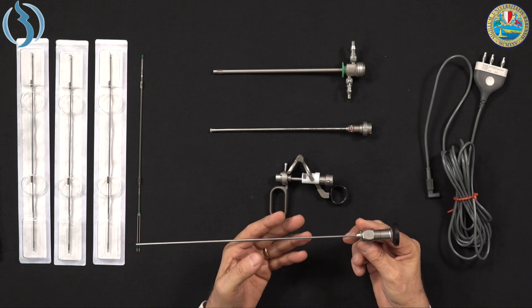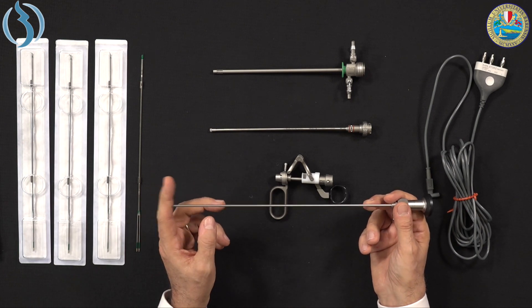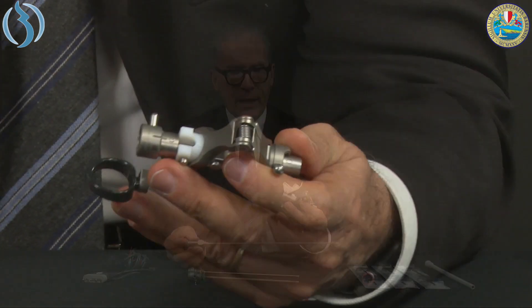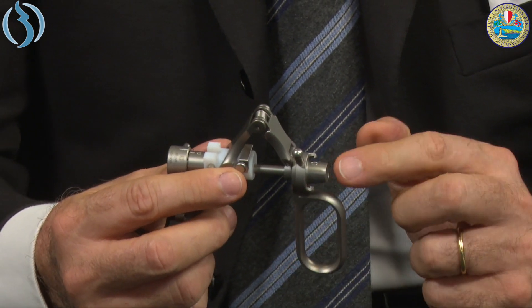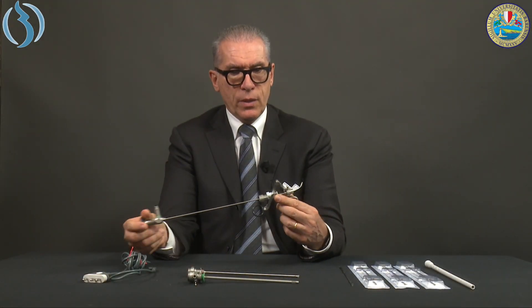Now we are ready to assemble the mini resectoscope. These are all the parts. We start with the optics: a 0-degree, 2.9 millimeter lens — there is no alternative because the loop is so small that it must be 0 degrees to have a perfect view of the loop during movement. The lens goes directly onto the working element. The difference from the classic resectoscope is the absence of a protective sheath around the lens — the lens is inserted directly onto the working element and serves as the connection point for the electrode.